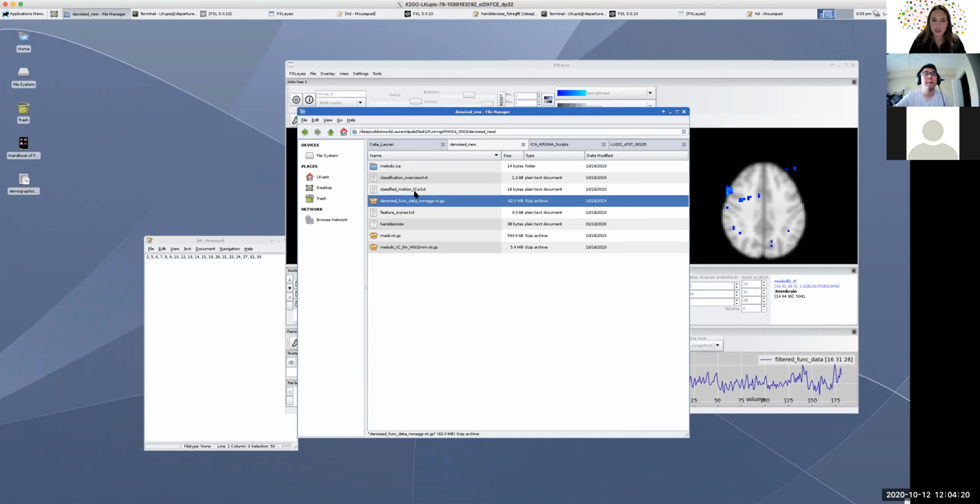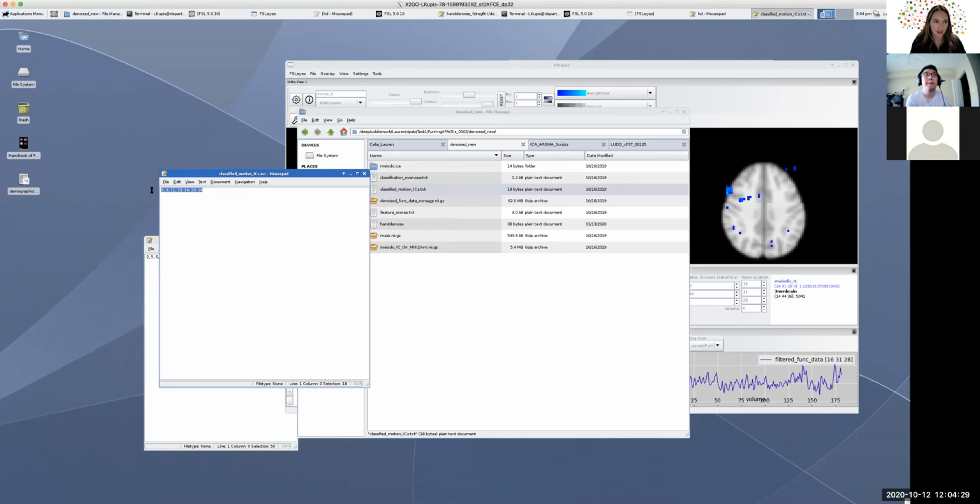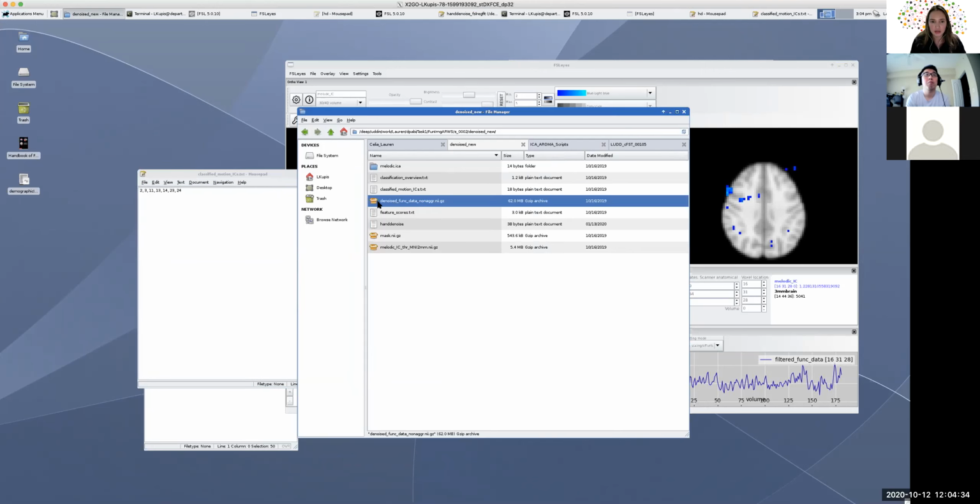So if they did a good job, you can look here at what they classified, and go through it and double check: did AROMA actually do a good job at classifying it for me? Then you're just going to use this file here, the func_data, for your next step. Usually, at least for us, for dynamic analyses, we'll use the ICA-AROMA file before doing further pre-processing steps, or you use it in your analysis, whatever you do. So that's the case if it does a good job.